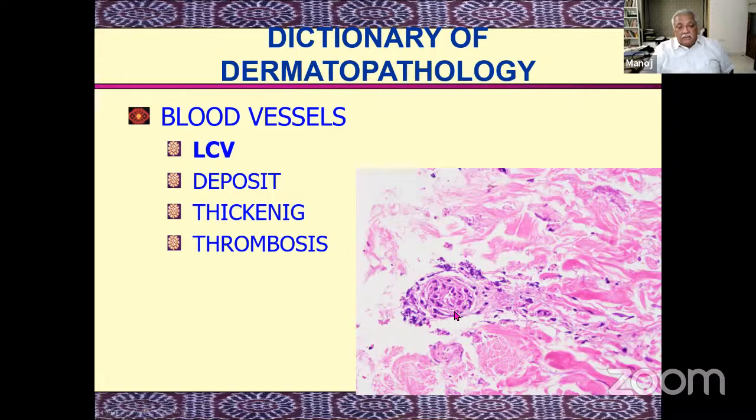Now, this is a capillary, right? This capillary wall is degenerated. There is inflammation around it. There may be a little bit of RBC sprinkling here because of leak from here. So this kind of immunological capillaritis is a particular type of disease, leukocytoclastic vasculitis. Now, this same kind of appearance may appear in the medium-sized vessels or in the larger-sized vessels. There may be deposits of certain materials, thickening, and or thrombosis.